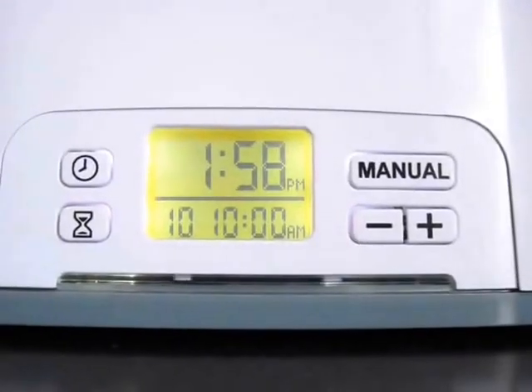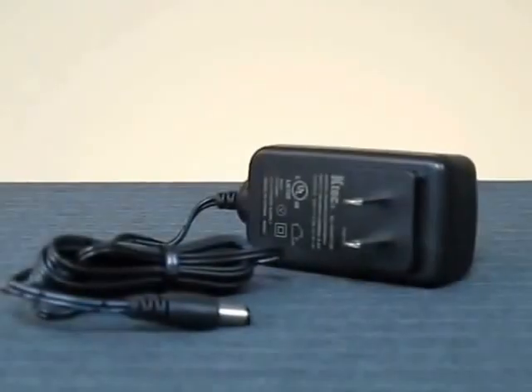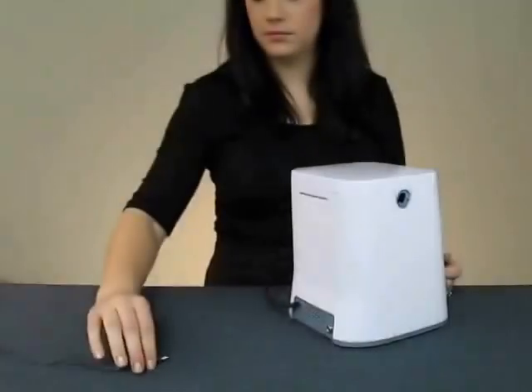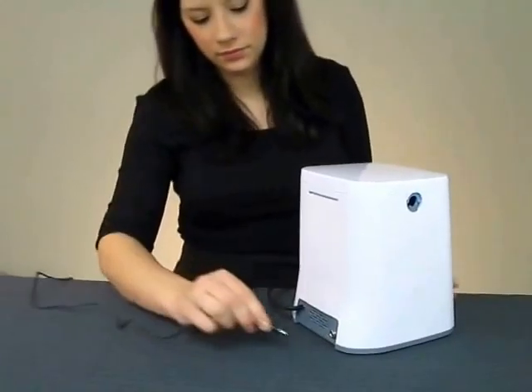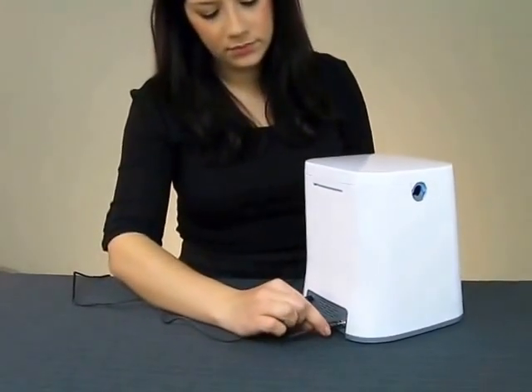To set the soak clean timer, power up your unit by plugging the AC adapter into the back of your soak clean and then into a wall outlet.